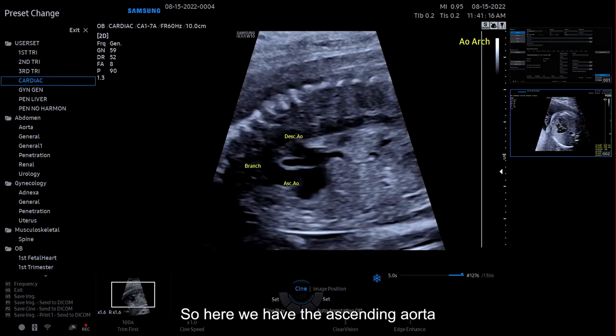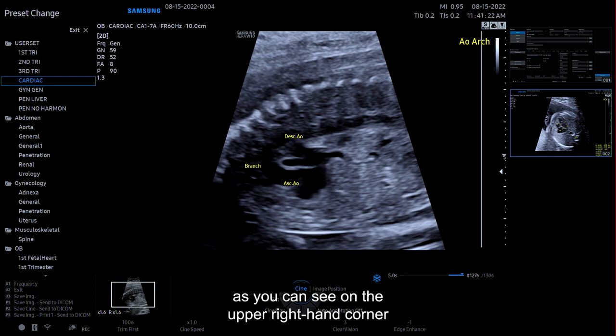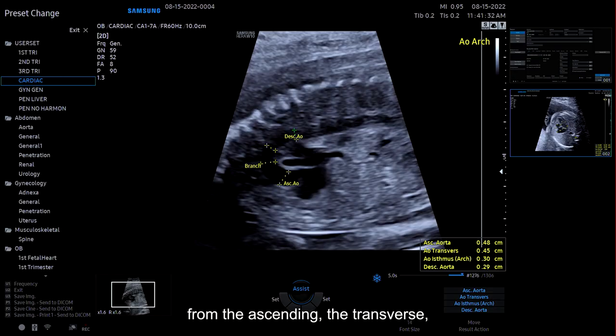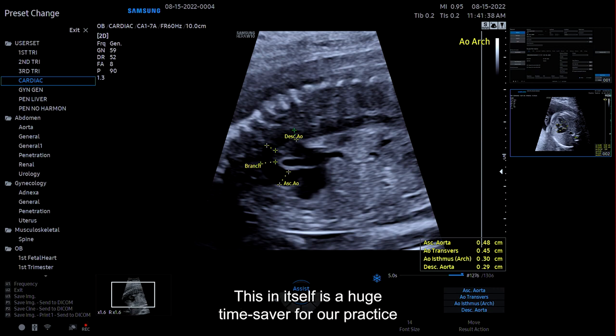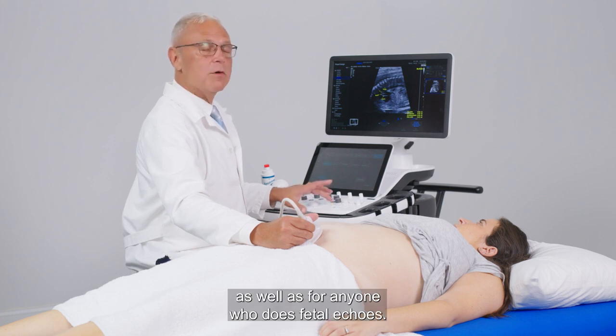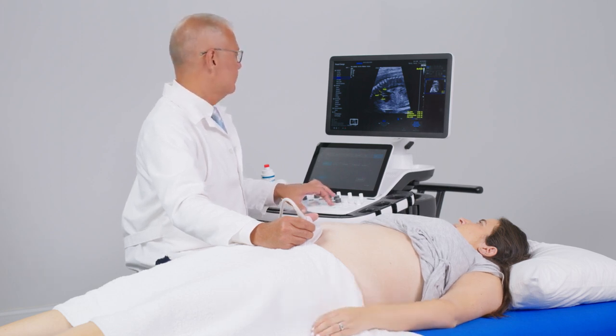So here we have the ascending aorta, the branch of the aortic arch, as well as the descending aorta. As you can see on the upper right-hand corner, it's actually labeled it as the aortic arch. When we hit the auto measure, then we also get the typical measurements from the ascending, the transverse, as well as the descending, and the isthmus of the aorta. This in itself is a huge time saver for our practice as well as for anyone who does fetal echoes.